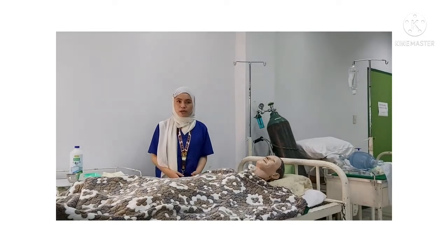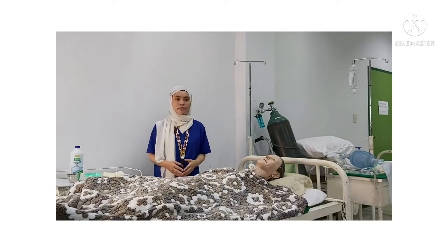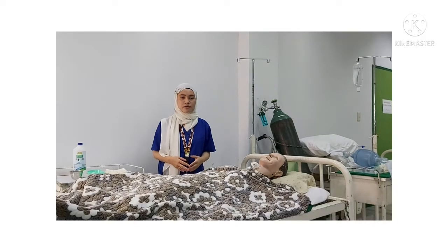So the equipment that we're going to use are the towel, the sterile gloves, the sterile water, suction catheter kit, the sterile disposable catheter, and the suction machine.